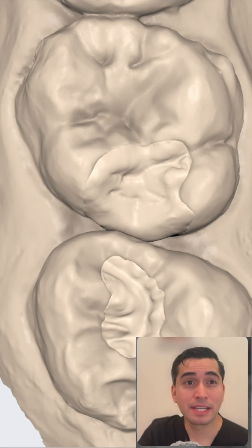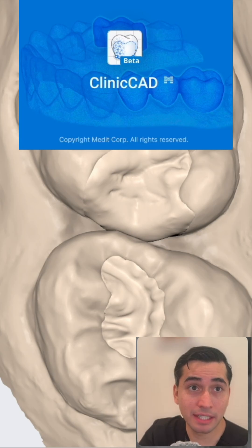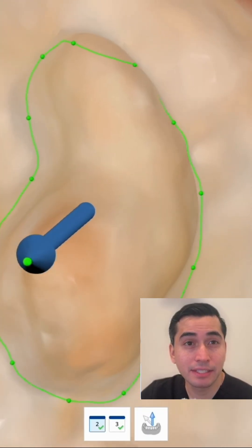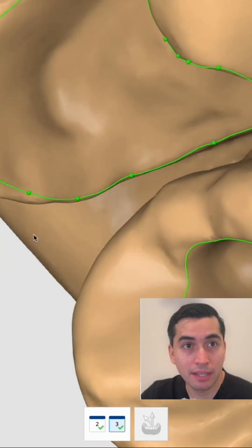Screenshot of the final design and the bitewing — really loving the anatomy here. Once in ClinicAD, the software automatically generates the green margin line and the blue stick for the path of insertion.